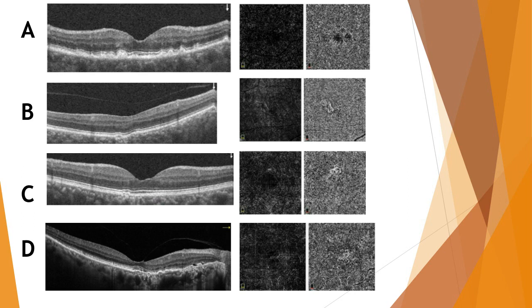So I share this when I do this lecture, and I say that patients like these have humbled me, because before the advent of OCTA, I never would have suspected that these patients had active membranes, and they certainly do. They're non-exudative, but they're there, and they're worthy of knowing, and they're worthy of looking at in more detail.